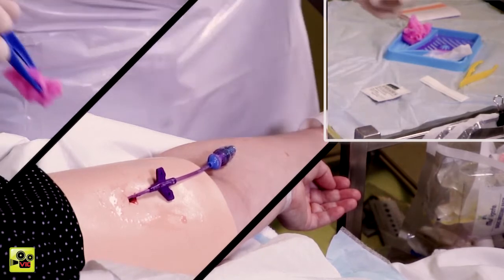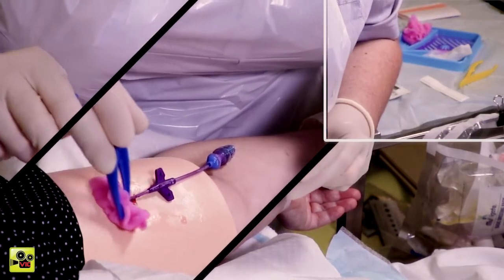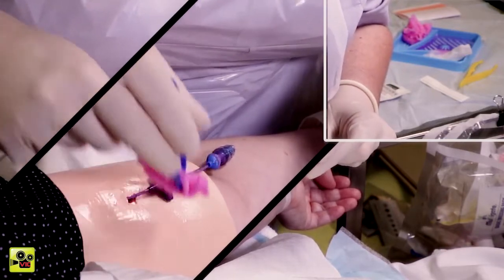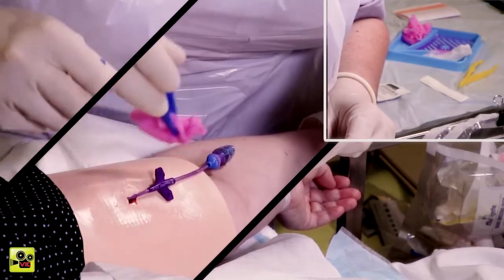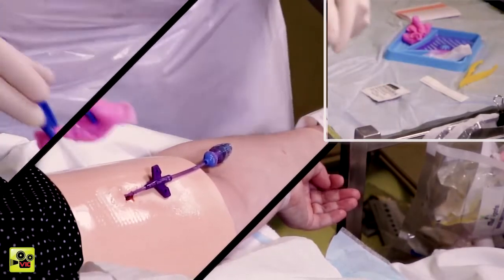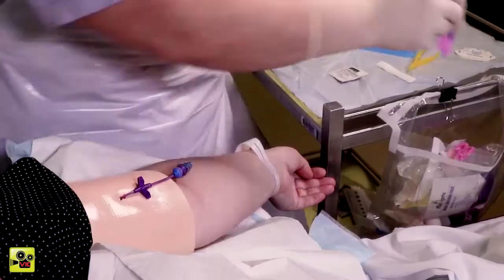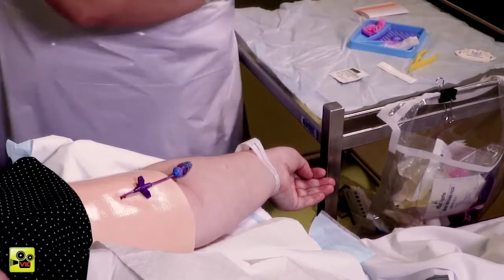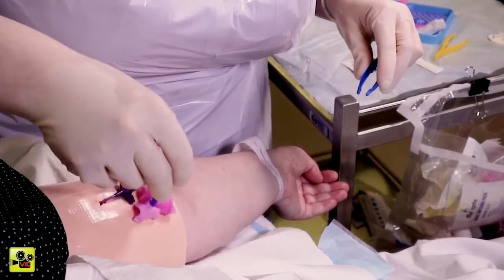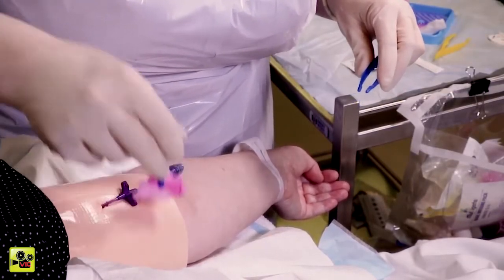I'm just about to start using the chlorhexidine now, and that one can sting a little bit. But we need it to clean the area. Does that feel okay? Oh, that's good. Yeah, it's cold, but it's not stinging. That's great to hear. I'm being careful not to move the PICC line because it needs to stay in place. All right, last one now.